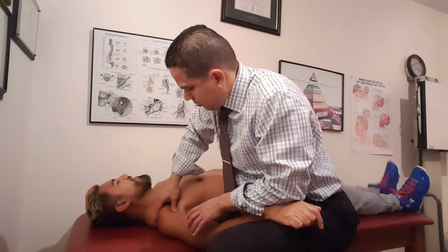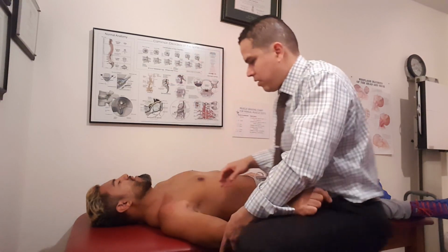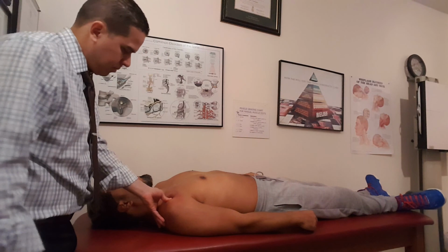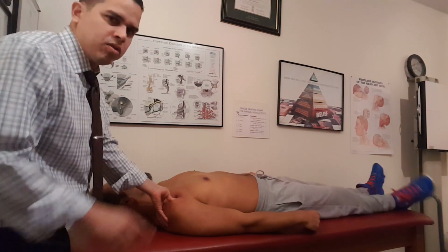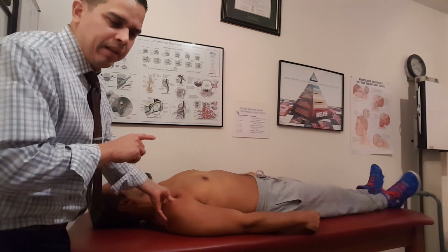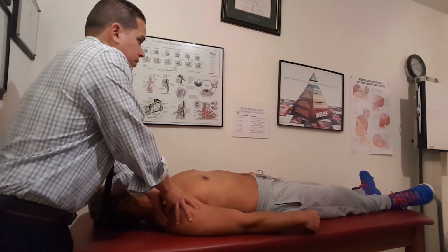Oh. Good there. All right. So let's bring this across here. So right here is where he's gonna get his pressure point. And again, what I'm feeling here is this tendon connection right into the bone. All right, so here we go.